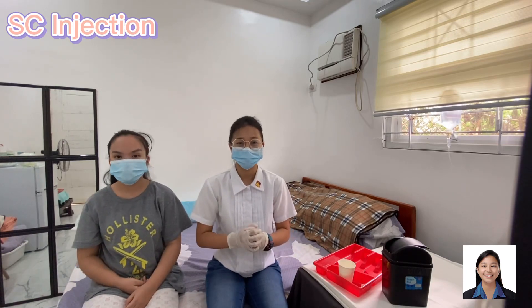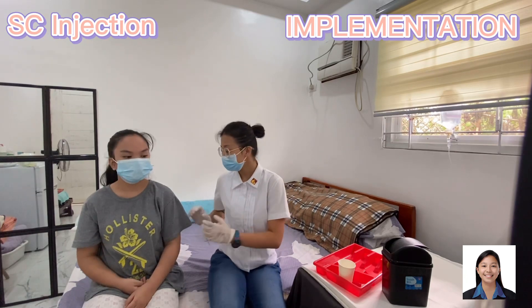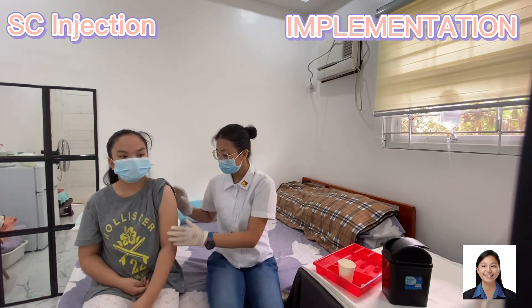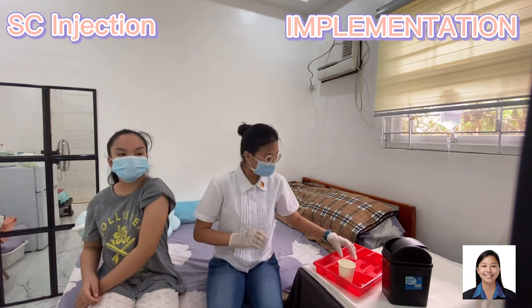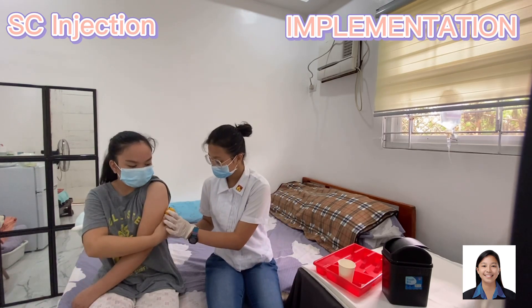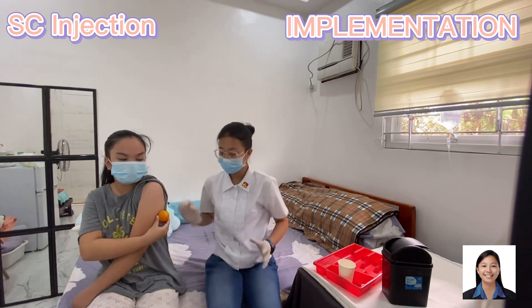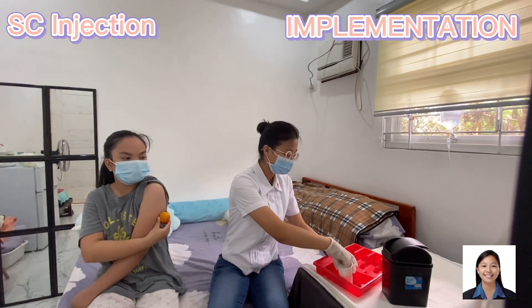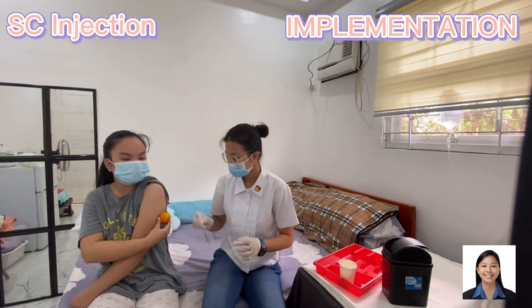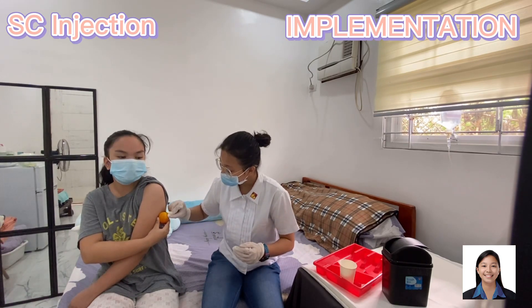Next, I will be demonstrating how to perform a subcutaneous injection. In doing subcutaneous injection, we'll choose the site at the back of the upper arm. Cleanse the area with alcohol in a circular motion, starting from the center going outwards.